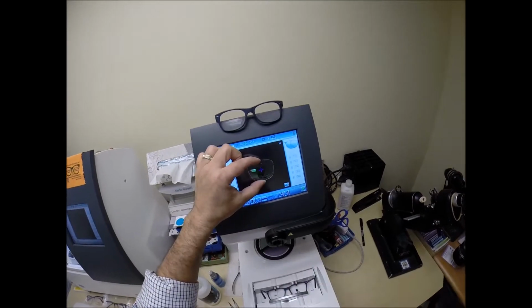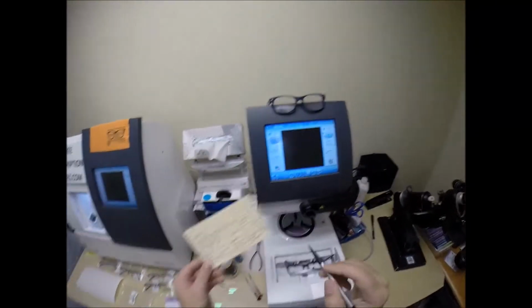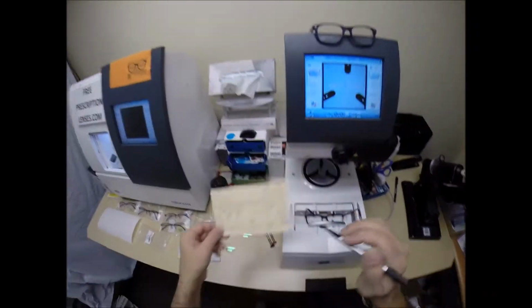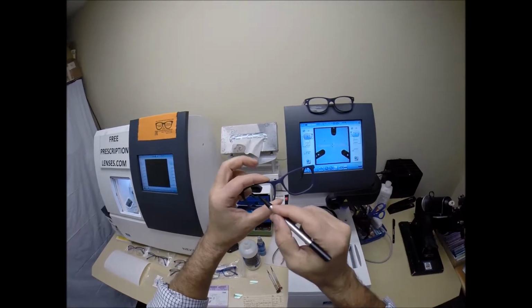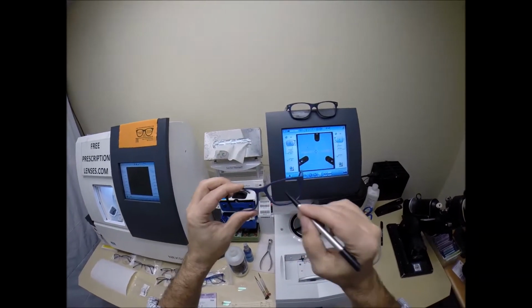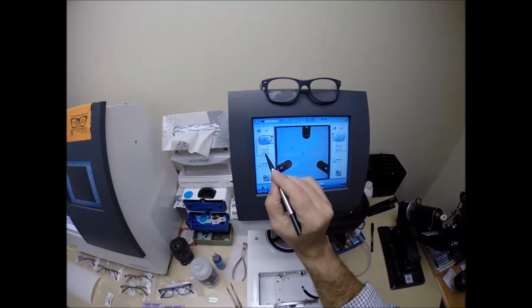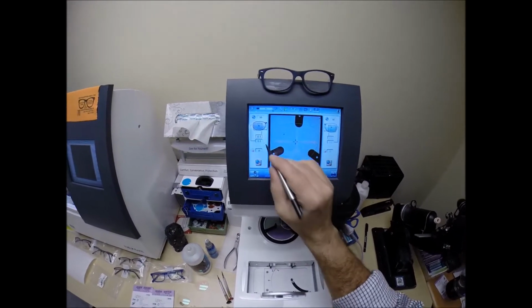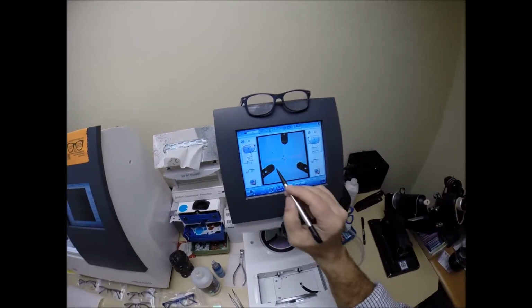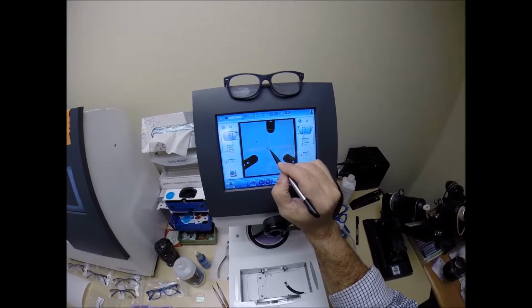So that is the shape of the lens we'll be cutting. Let's go ahead and move it on to the next screen. Your pupillary distance is 33, which is the center starting at the bridge of your nose and going outward in each direction. For your right eye, hang on, that's your right eye. It's 33 millimeters this way. The computer starts at 32.5, so I'm going to tap this plus button one time because it goes up in half millimeter increments.